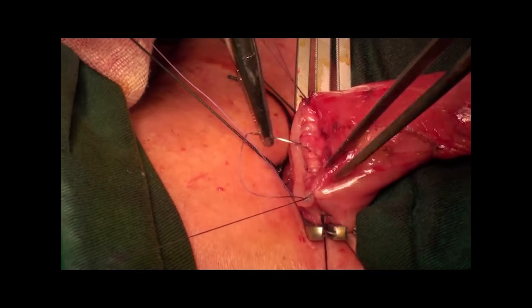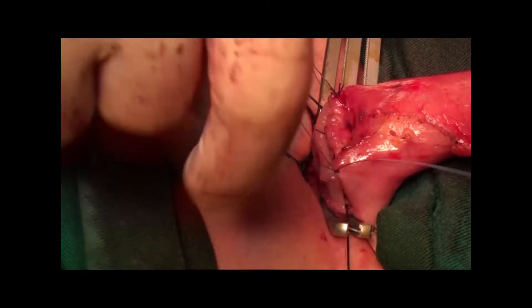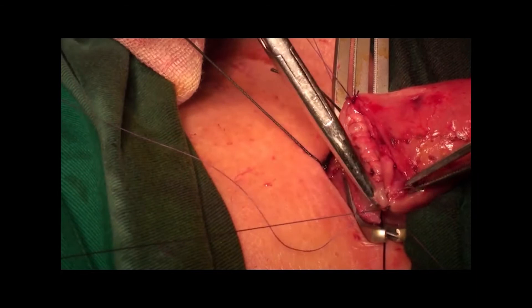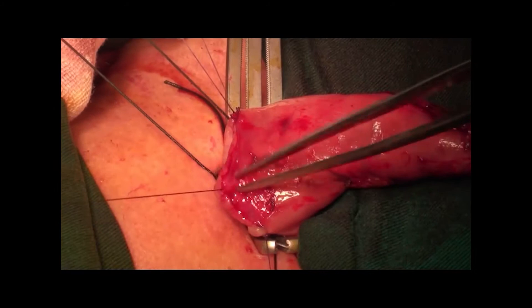The purse-string suture was adopted at the 9 o'clock site. Cutting the former threads and hanging the 4-0 suture using mosquito forceps. Continuous sutures were also used for the posterior side.